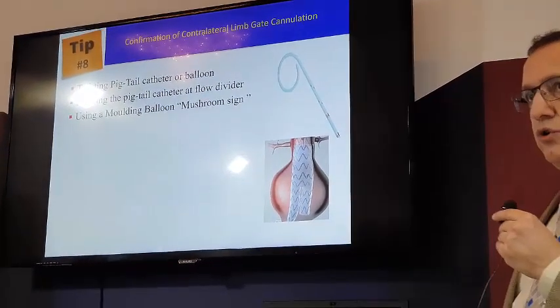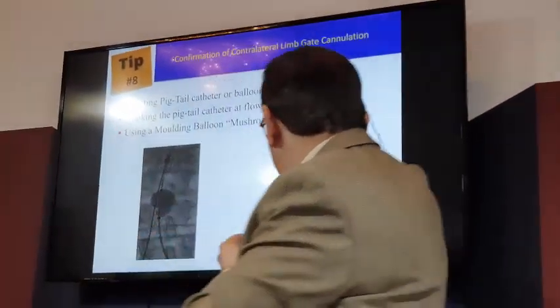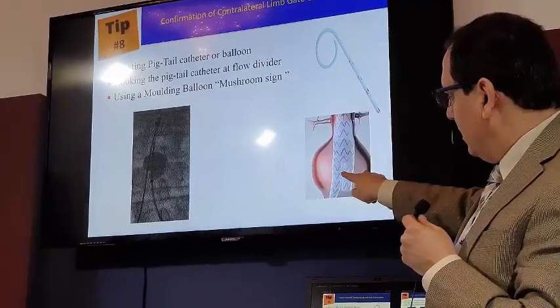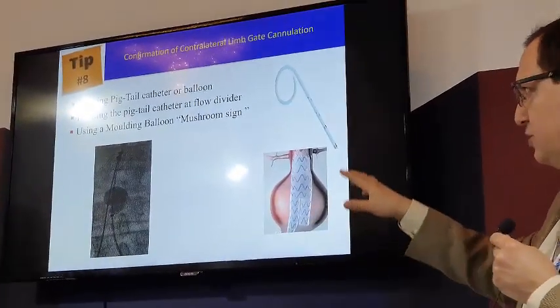The third way, you can do it by what we call a mushroom sign. You put your reliant balloon inside this part, and you inflate the reliant balloon. The balloon will bulge here and bulge a little here because you are inside. So it gives you a mushroom sign. This is to tell you for sure you are inside, because if you are behind, you will not get this mushroom sign.